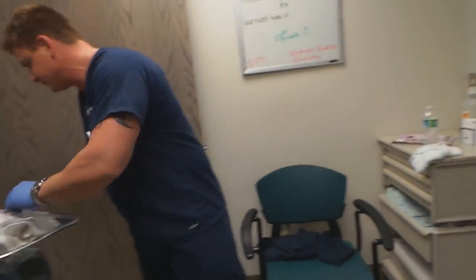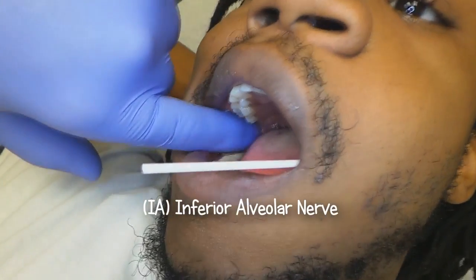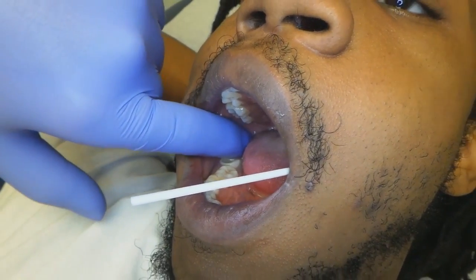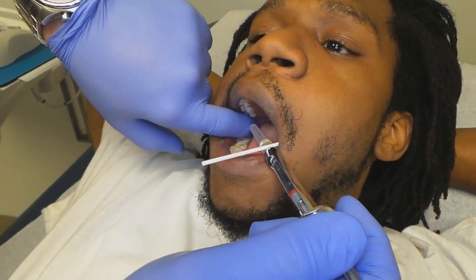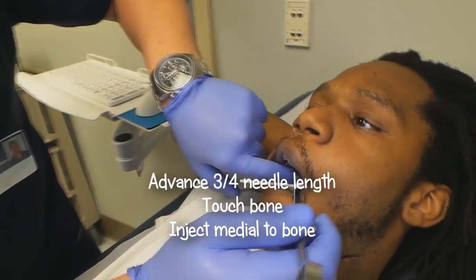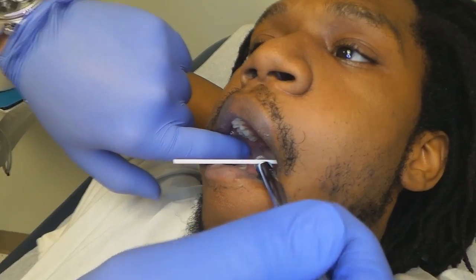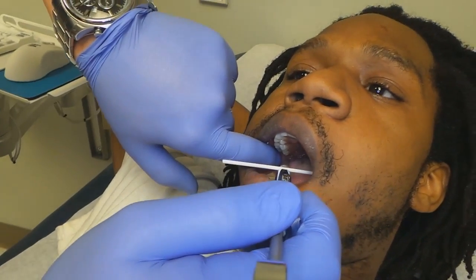So what you have to do for the mandible — I'll just show that one since we're not giving that injection. You want to palpate, feel the ramus, push your finger straight back, and you'll feel a little divot. Take the needle, come across from the second premolar on the opposite side, stick the needle in and advance it. Using one of these long yellow needles, take it about three quarters of the way in, bringing it in across. You'll actually nick the bone — you'll feel it. Once you feel the bone, you may need to manipulate the needle while it's still in the mouth and advance it a little bit further back.